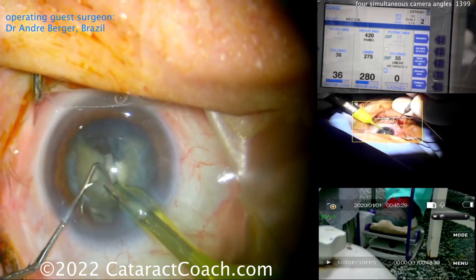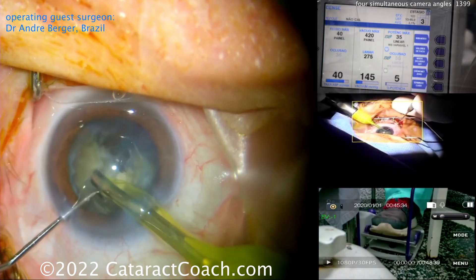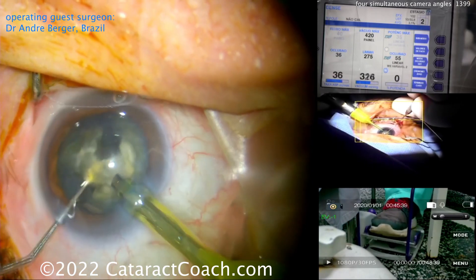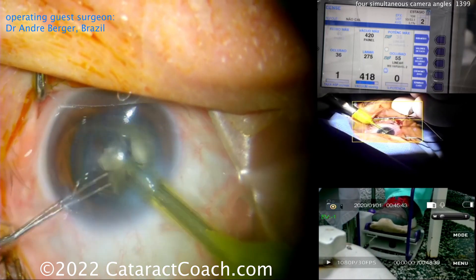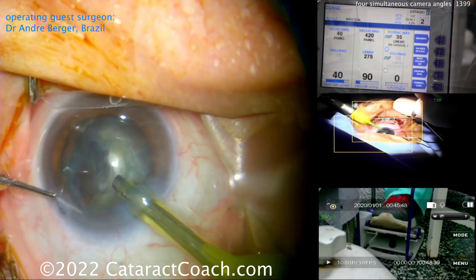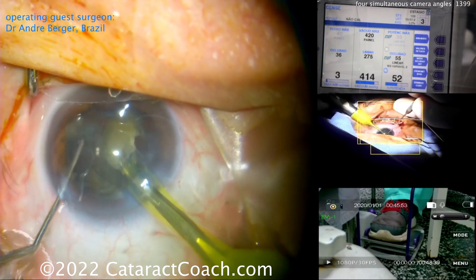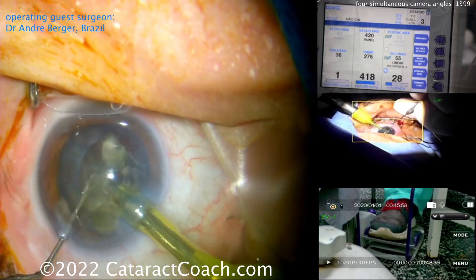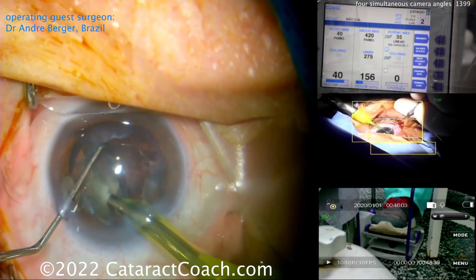Look at the right foot on the phaco pedal in the bottom right corner. Notice how he's just dialing it in little by little — he's not going on or off. He does it like you drive your car: you give a little pressure on the accelerator or a lot, but you don't come on and off it. He modulates his foot to give energy only when he has occlusion — his machine makes that occlusion noise — and he knows when it's occluded to give more energy. That is key.